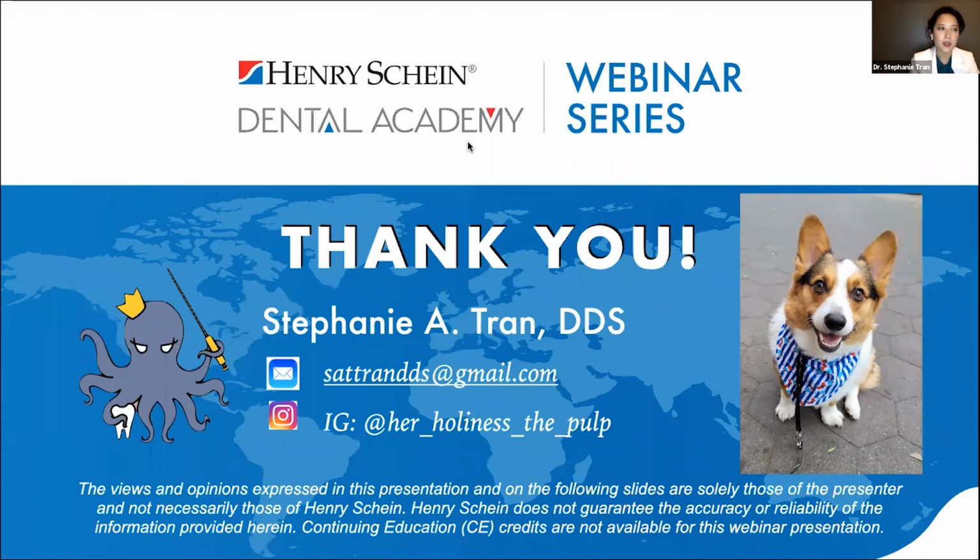I can't give you exact specifics. It's essentially a sextant. The reason I don't give exact dimensions is that it depends on the machine. Each machine has a slightly different definition of what they define as a limited field of view, but basically it's the smallest quadrant or sextant scan. So you have to look at that on the machine.